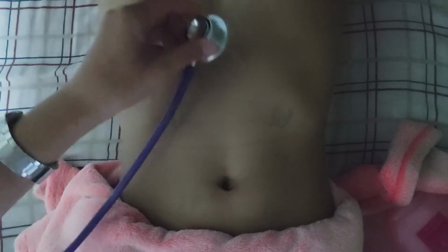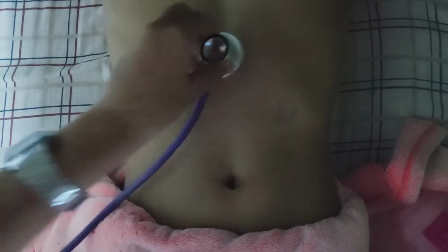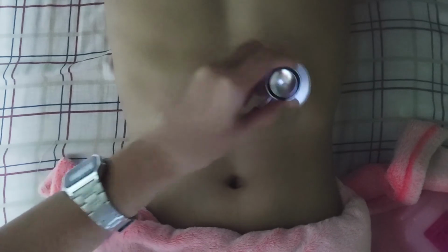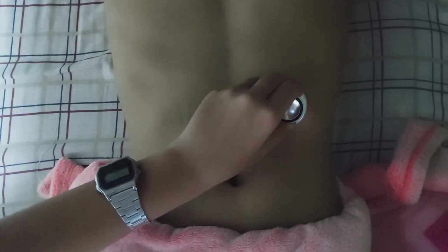Okay, here. Okay, none. It's noted. And then we're gonna listen to left and right renal artery. So here's the right. Okay, none. Noted.